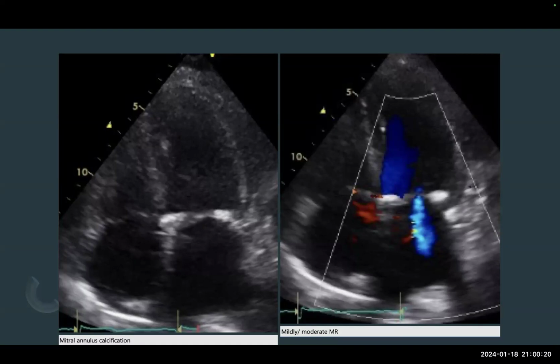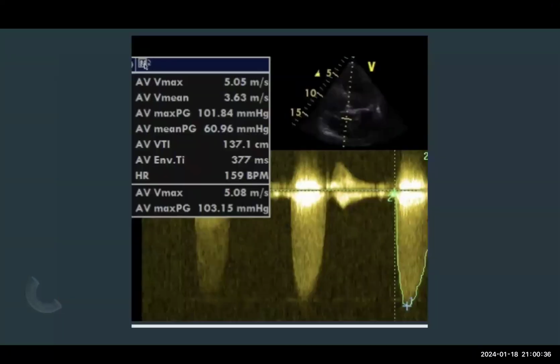Mitral regurgitation means there is a problem in the ventricle, and that's why it's dilated and getting regurgitation, or it is because of what I mentioned, the increased systolic pressure. And here is how they calculate the gradient: by tracing the pressure. If a patient has atrial fibrillation, you need to take several readings, like five, and get the average. The cutoff for mean gradient is 40 for severe.